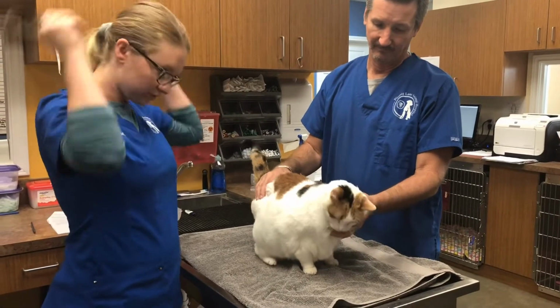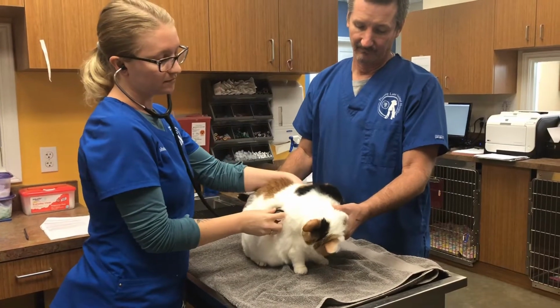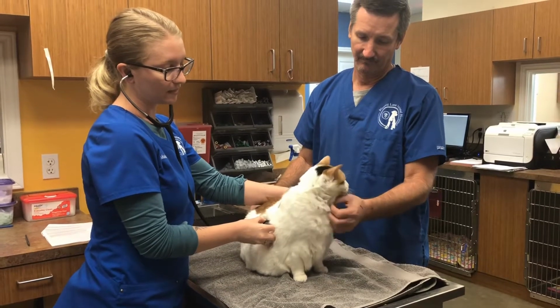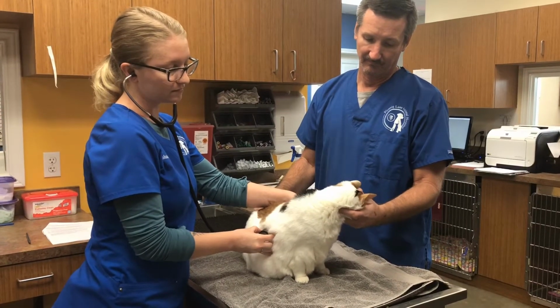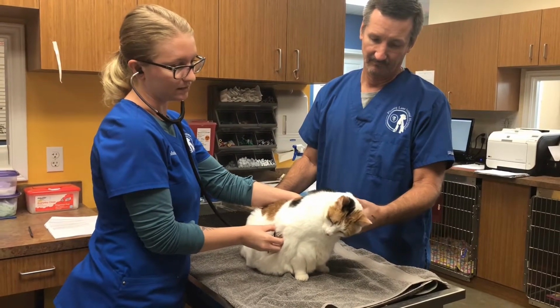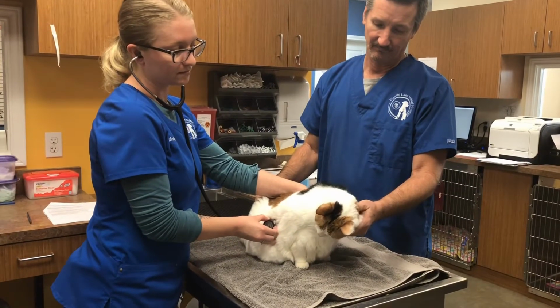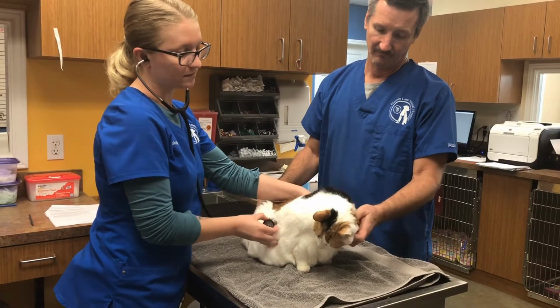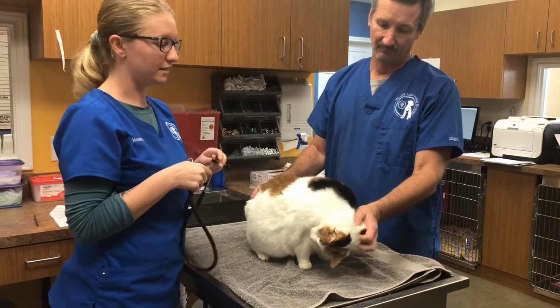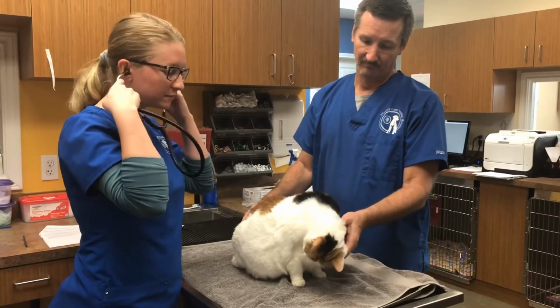Next, I'll listen to her respiratory rate also, so we'll auscultate each lung field. And they have 9 quadrants on each side, so you just need to listen to each of them. So she took 6 breaths in 10 seconds. So if you multiply that by 6, you get 36 breaths per minute, or 36 BPM. I'll listen to the other side.